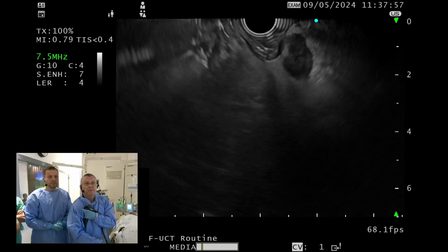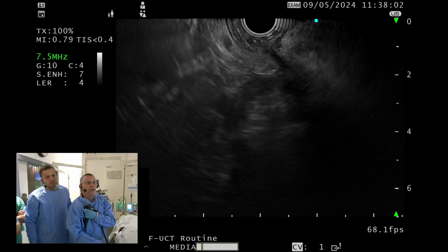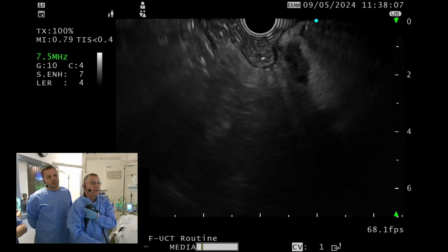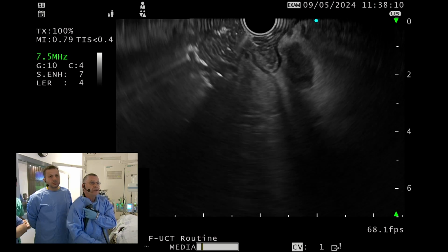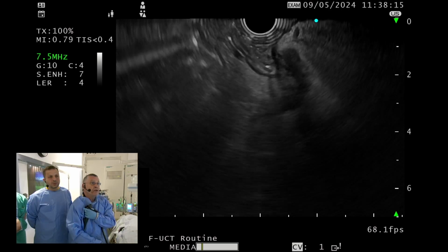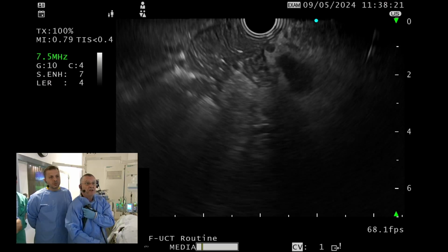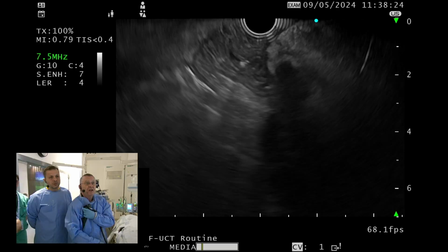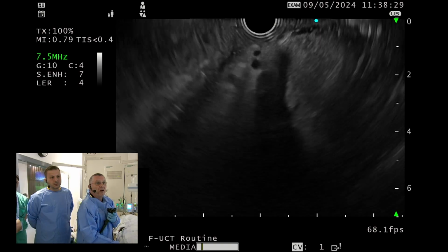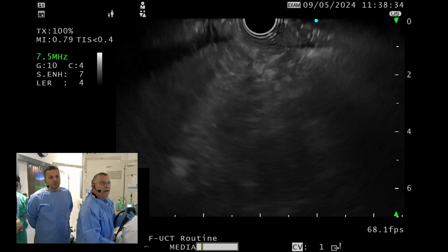You see this node? Okay? So when it's a small thing, if you have to do a sphincterotomy and the stent, it's finished. Finished for the diagnosis, finished for the staging. You have to remove the stent, you do the biopsy, till the moment you have the lesion which appears on the histology. But do not ask EUS to do the diagnosis of a small ampullary tumor, intra-ampullary tumor after endoscopic sphincterotomy.